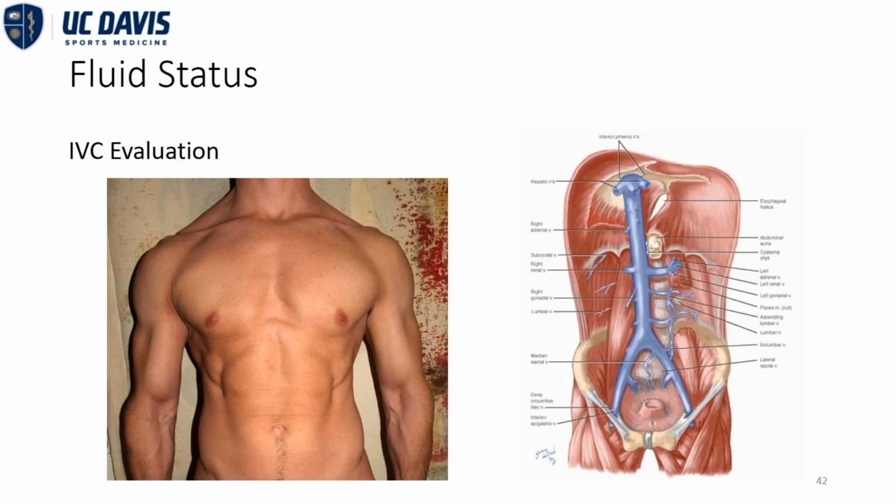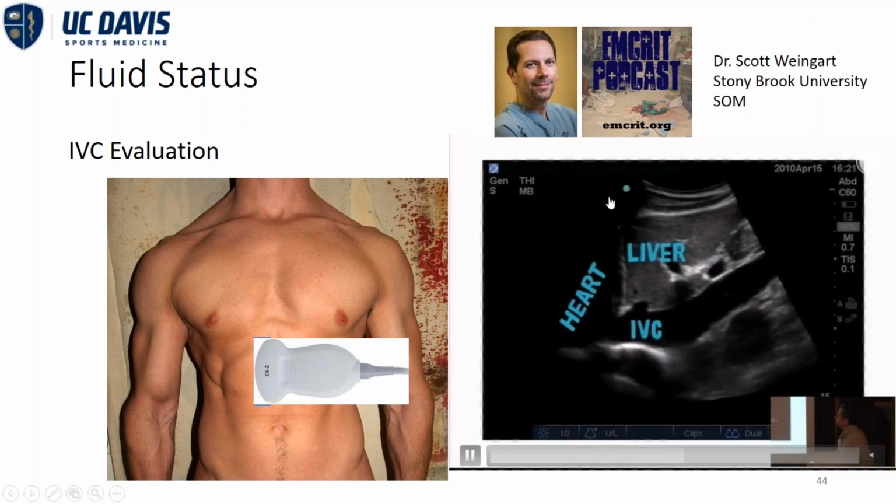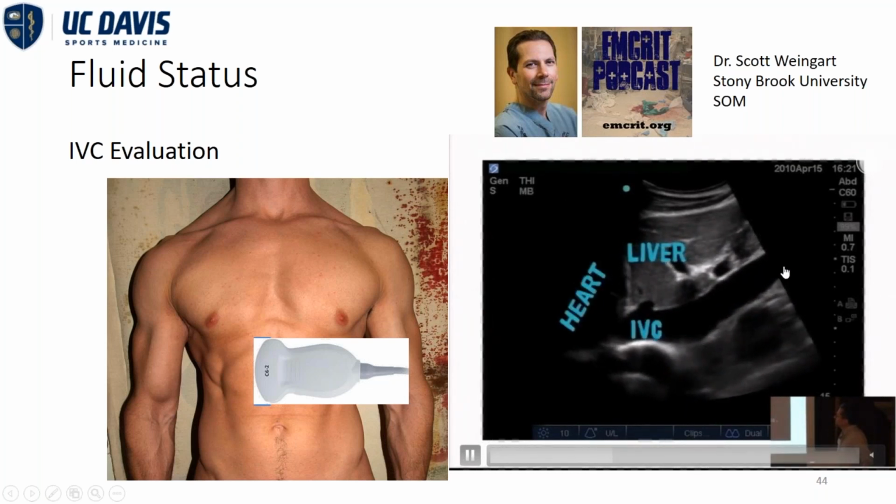It's important to remember that your vena cava lies on the right side of your intra-abdominal cavity. So you're going to put your transducer several centimeters on the patient's right. And on this setting, I want to utilize the curvilinear transducer. This is going to give us a nice broad footprint, as well as good image quality. We're going to use our liver as our acoustic window, and the probe indicator here is towards the patient's head. What we're seeing towards the patient's head is going to be the right atrium. What you see is the inferior vena cava coming into the right atrium.